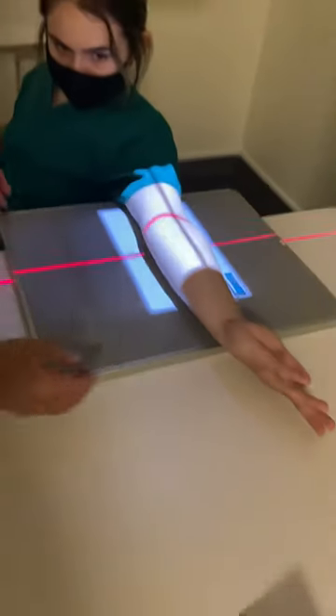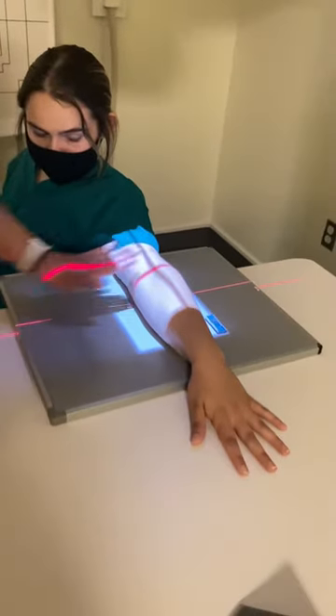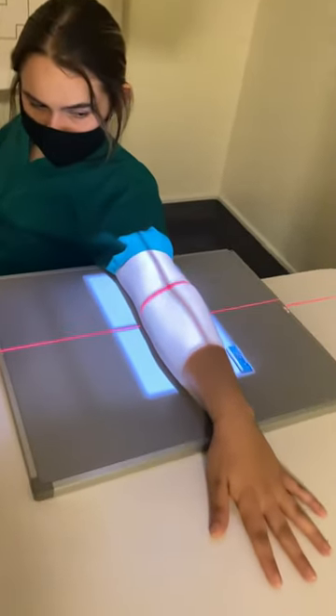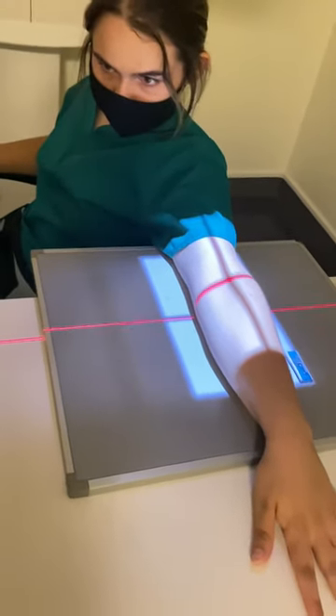Now I'm going to have you roll your arm in so that your thumb or your hand is down. There's going to be a 45-degree internal rotation for this one. Have them hold nice and still and take that image.